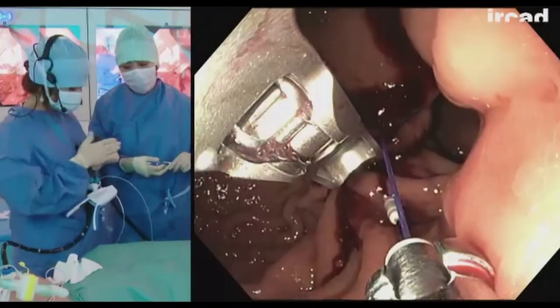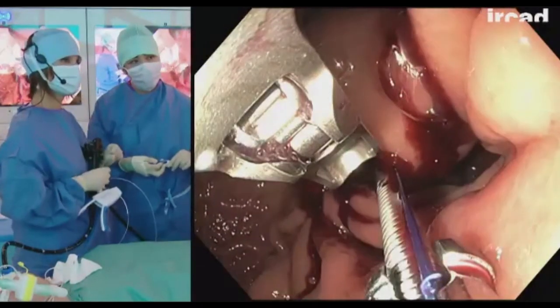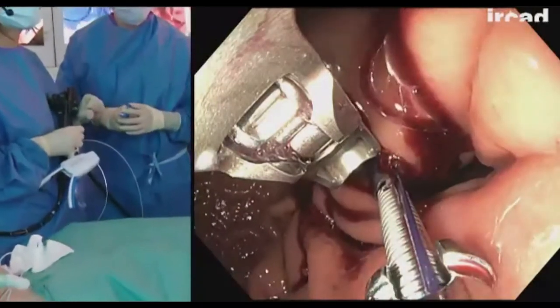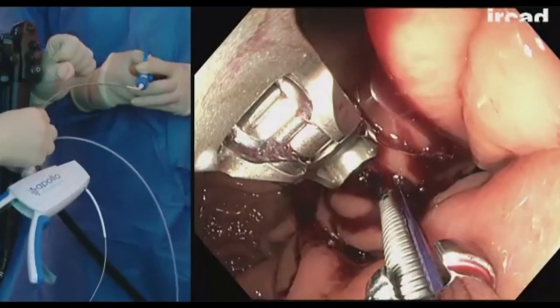So I'm holding the scope with my left hand and I'm pushing the cinch down with my right hand. Very gentle, push and release, push and release, always feeling what's going on here, the tension. And now, Rita, very gently, it's gonna close.